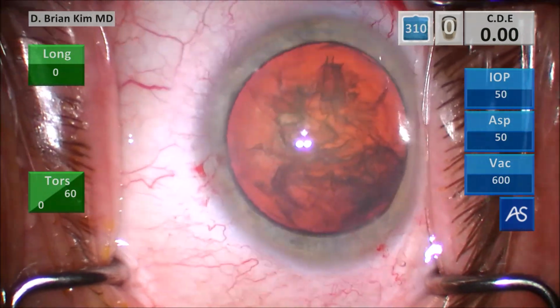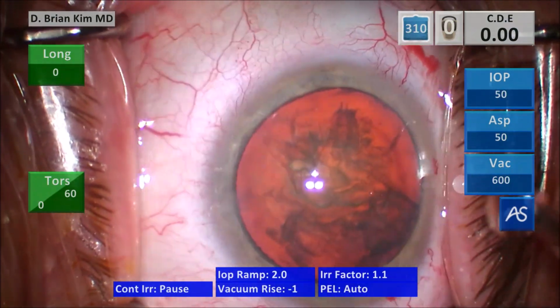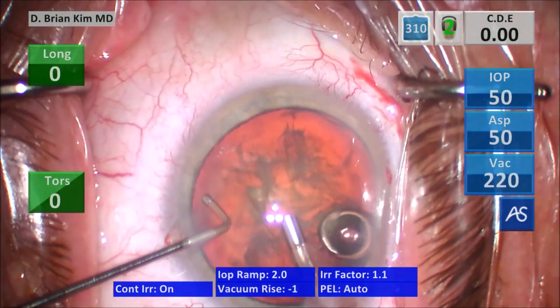You can tell this is the left eye. This patient has a little bit of a Bell's reflex, a little bit of jiggly eye movements here. Irrigating the surface of the eye, lifting the incision with the chopper, going in with irrigation off to minimize Descemet's trauma, and then removing the surface epinuclear material.